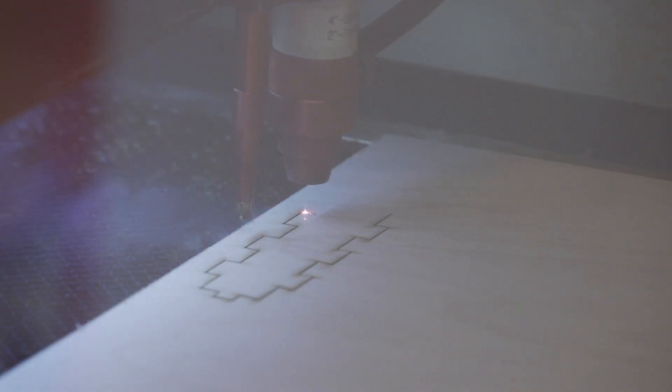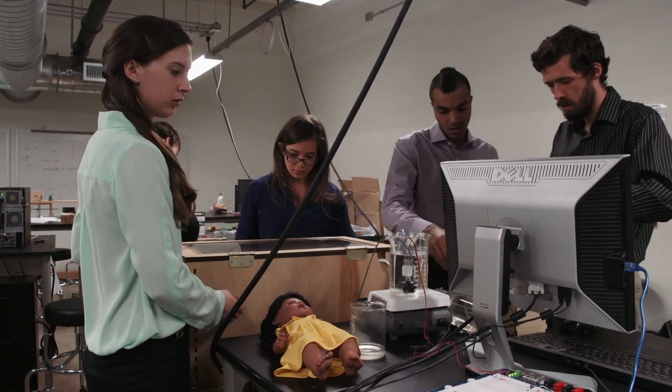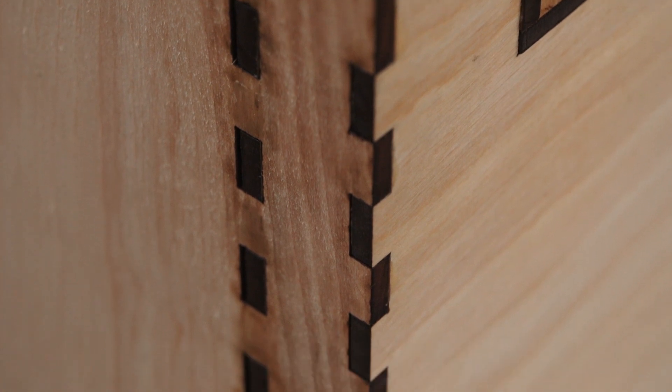Currently it's made out of birch and acrylic. The reason it's lightweight and thin is that it makes it easier to laser cut. Additionally, when it is laser cut, it can be flat packed, so in order to ship it to Malawi, if we flat pack it sort of like IKEA, it's a lot easier to get it over there.